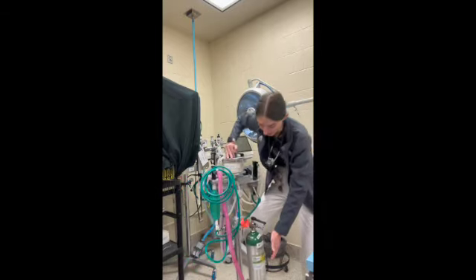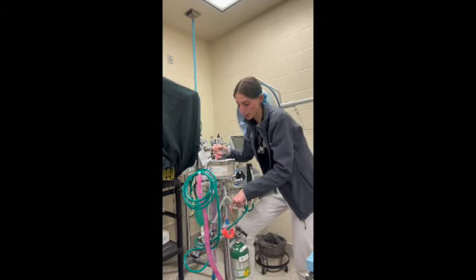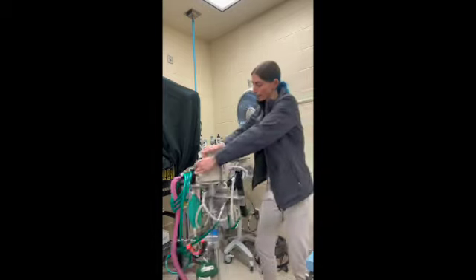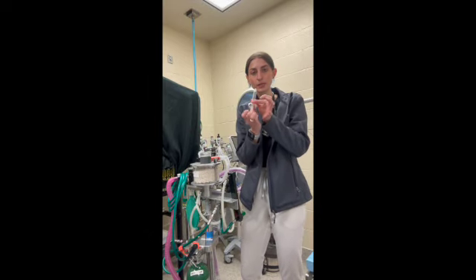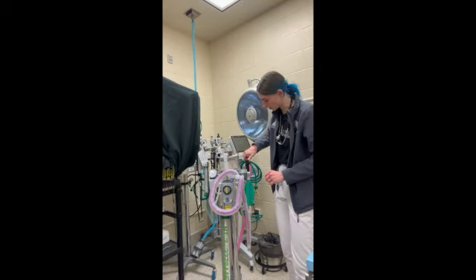But we do have the smaller E tanks here that stay connected to our machines. You always want to make sure you're checking how much is left in your tanks before you begin your anesthetic event. Something else we keep on our anesthesia machines is our syringe for any cuff inflations, and a pop-off valve here at the top.